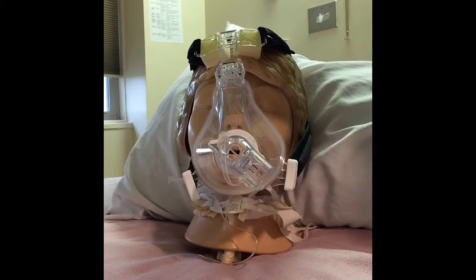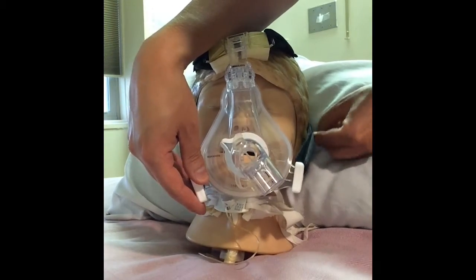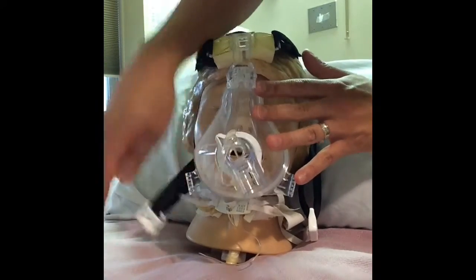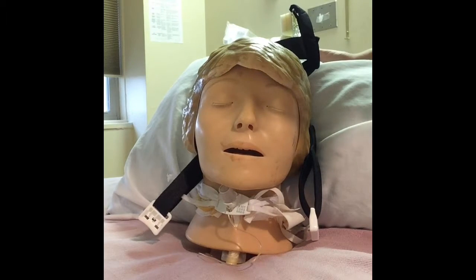If they're going to be off for a while, I don't like to take the Velcro all the way off. It's already set to their face. Just pop these things off and take that mask off completely, and then stick your machine in standby.